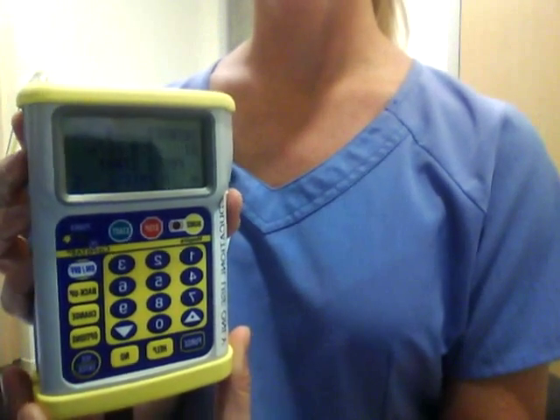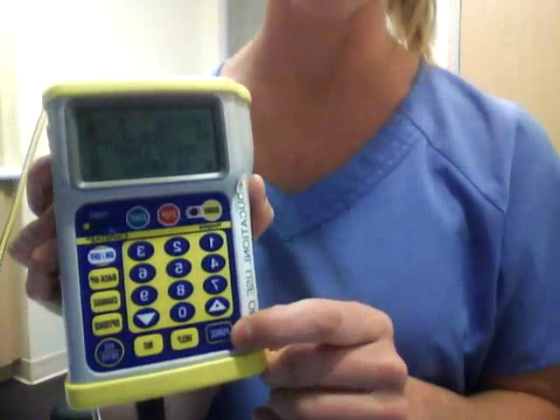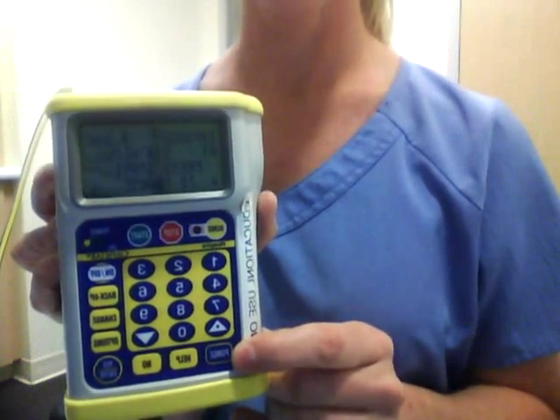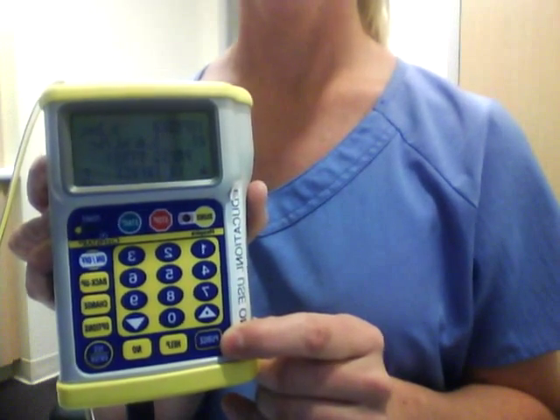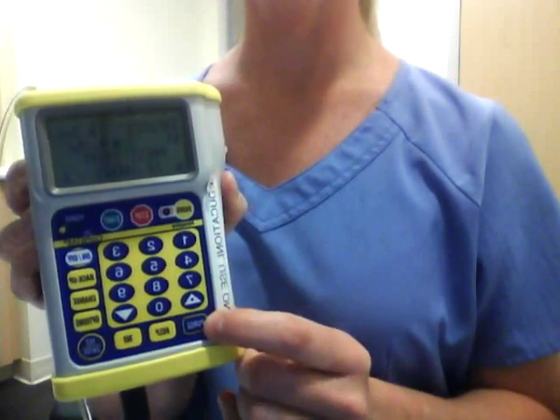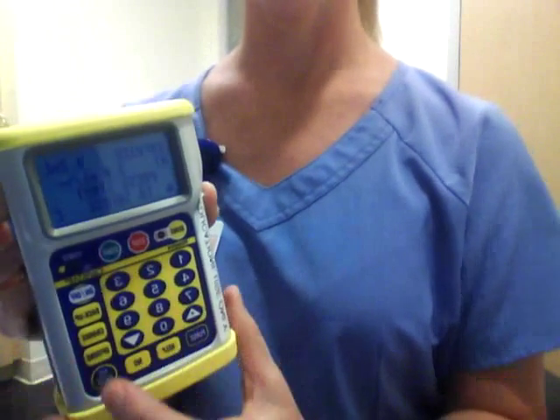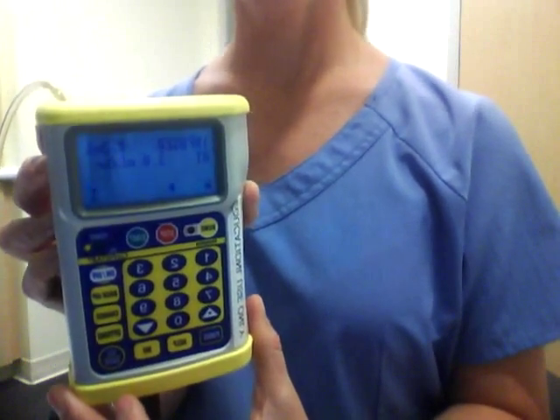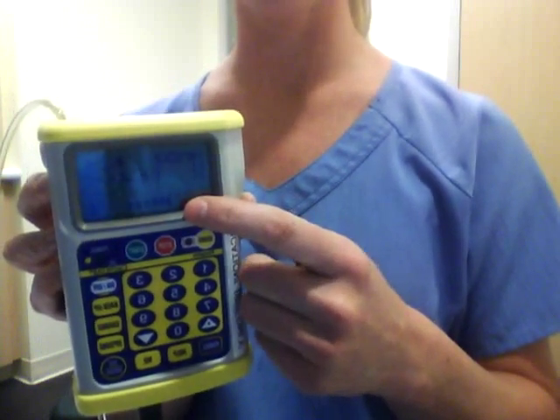If at this point you need to prime your line, you just hold down the purge button located on the right side of the machine here, until priming is complete. And then to start the infusion, all you have to do is press the green button that says start. You know the machine is infusing properly when the arrows are moving across the bottom of the screen.